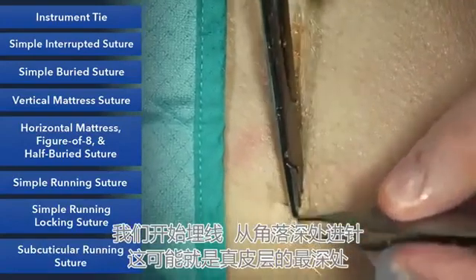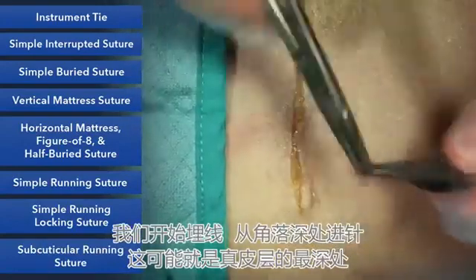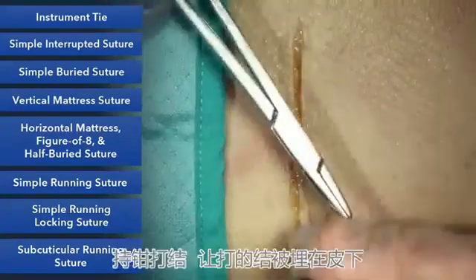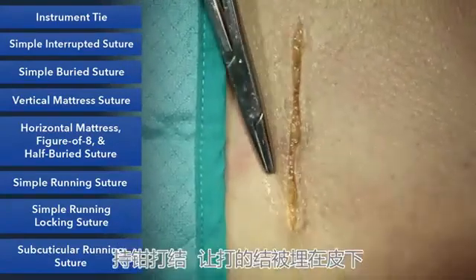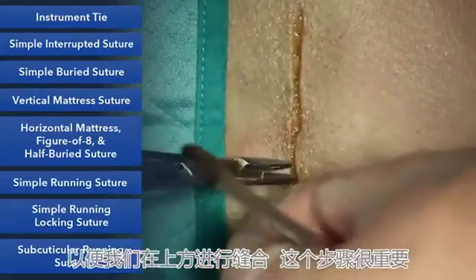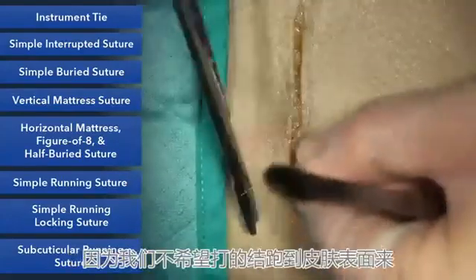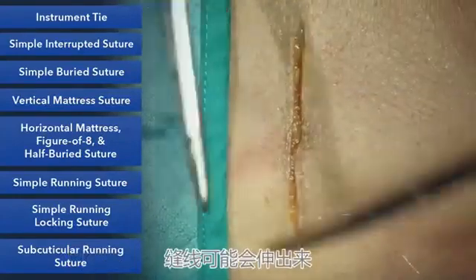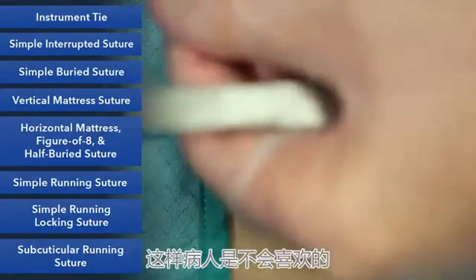This is an absorbable suture, and we will start by burying the knot. So I'll go deep in the corner, away from the skin, maybe just the very deepest part of the dermis. And we'll do our instrument tie, and this allows the knot to be buried so we can suture over it. This is important because we don't want knots coming up to the skin. They can stick out. It's called spitting. Patients do not like it when the knots spit.